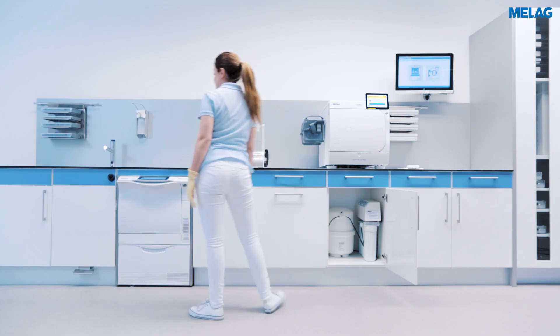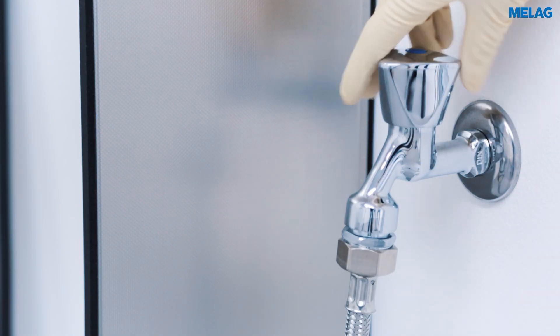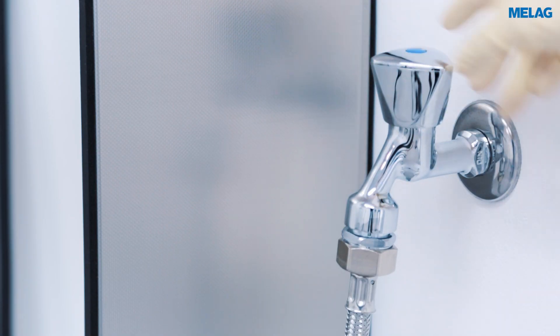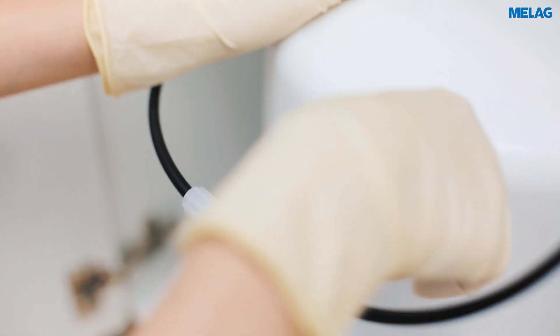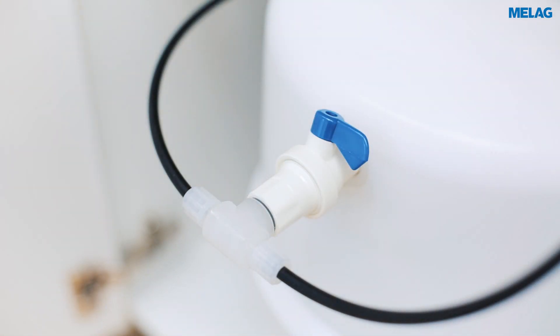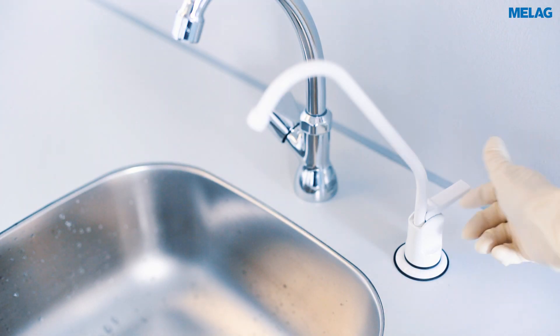Please close the water tap of the supply line and the shut off valve of the pressure tank. Then take out some water from the dispensing tap to depressurise the system.